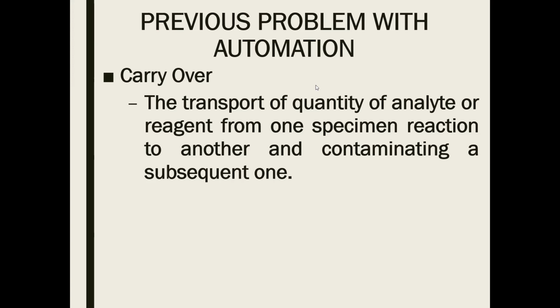Remember also the contamination of our sample by previously aspirated sample. And this is avoided because it can cause interference. This is avoided by internal or external rinsing stations or the use of disposable pipette tips of our analyzers.